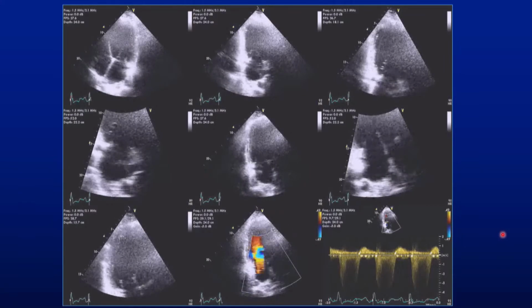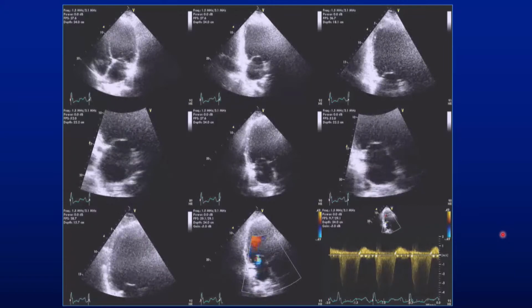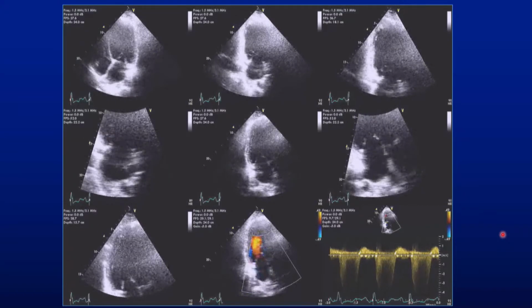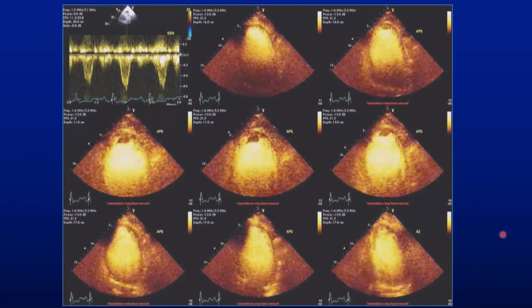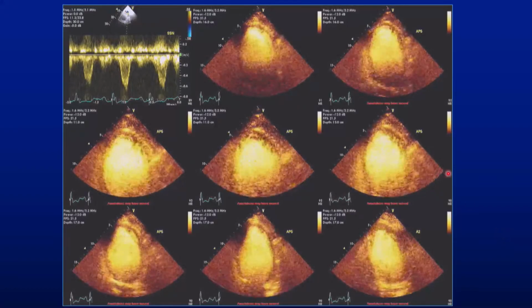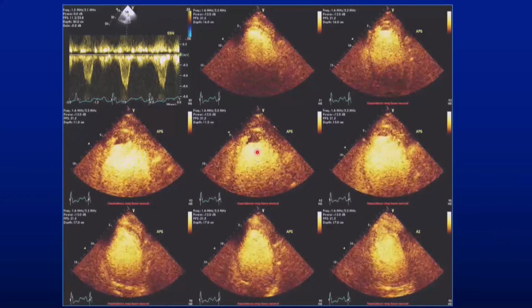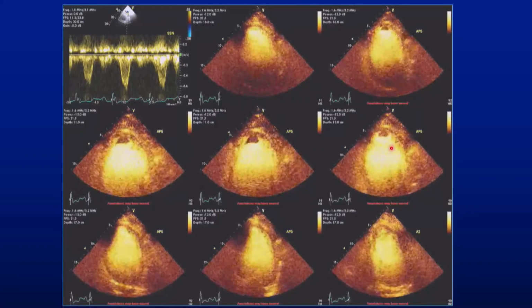So you won't be too wrong by saying that this is a very depressed ventricle, most likely an ejection fraction less than 25% or something like that. You won't go completely wrong. But you'd be missing something, because I'm not seeing it, right? You could see the thrombus very nicely there, and obviously somebody who would be at risk of an embolic phenomenon.